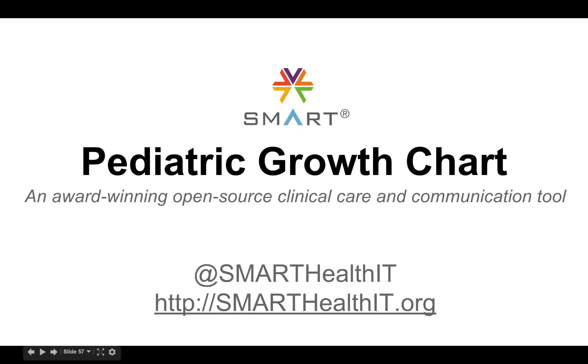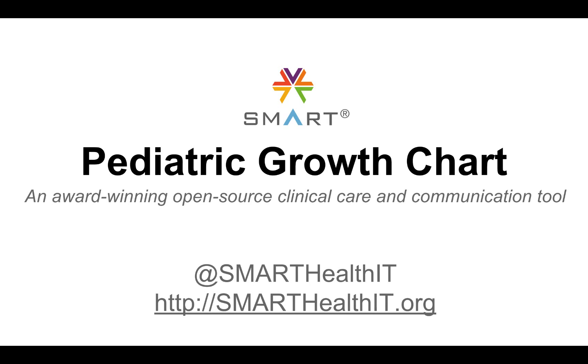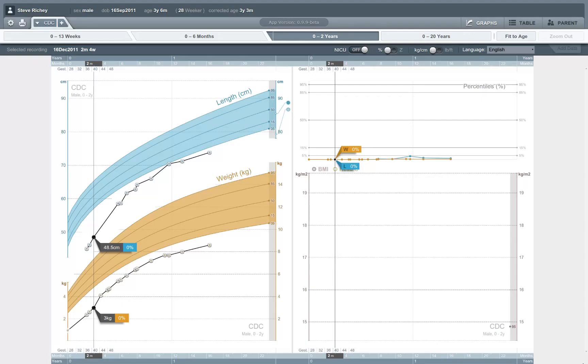The Smart Pediatric Growth Chart is an award-winning tool for providing clinical care and communications with patients and their families. It was designed in collaboration among the Boston Children's Hospital Smart Health IT team, the Fjord Design Firm, the MedAppTech App Development House, and a number of clinicians at leading children's hospitals. Here I'll take you through a quick tour of its features.